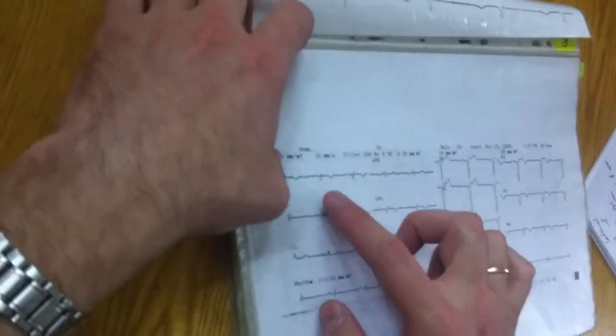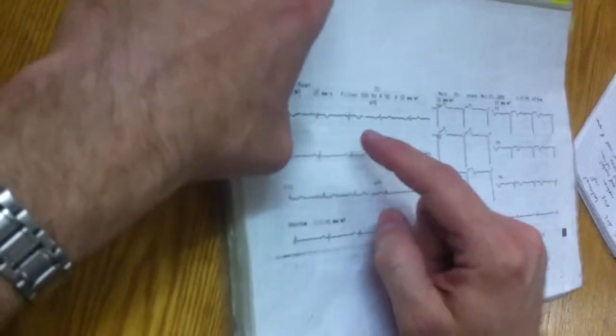And then the changes. You should pay attention to the pathologic Q waves. If you see them, for example, in the first lead, and then on the AVL, it says about a probable history of MI. Also ST elevation or ST depression, so ST deviation relative to the isoelectric line.